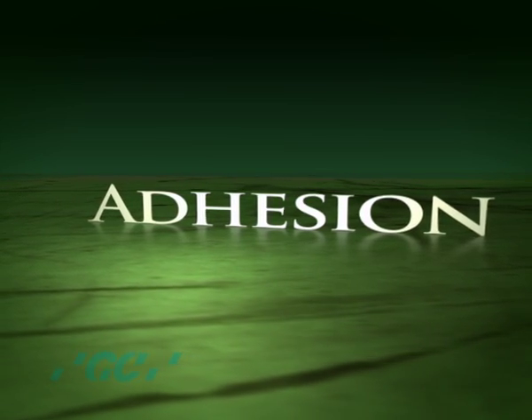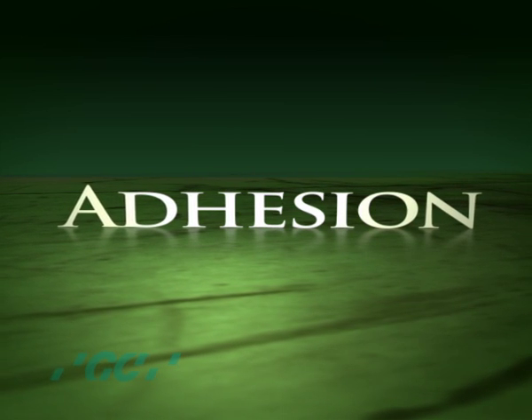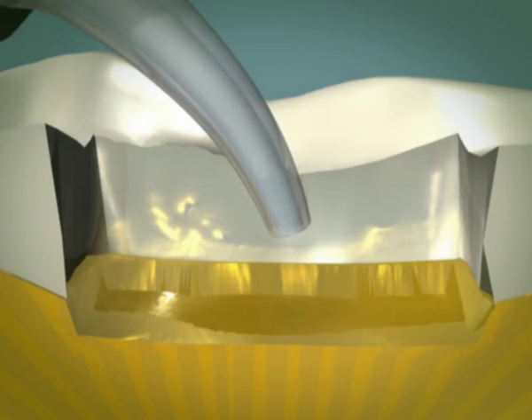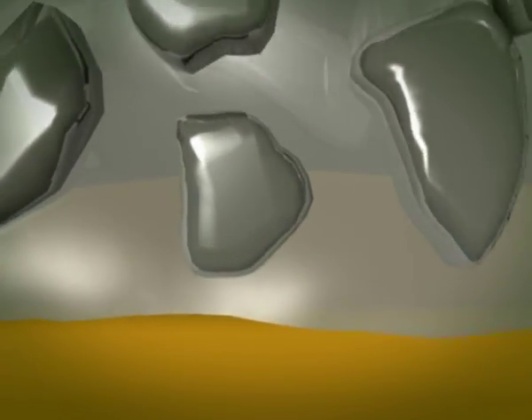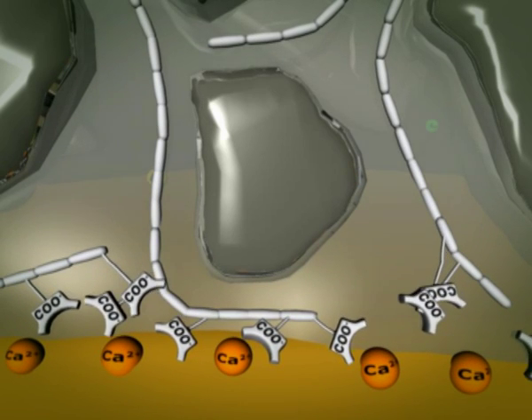Immediately after mixing, it is essential that Equia Fill is placed while it has a glossy surface. The gloss is free polyacid, which is able to penetrate the cavity surfaces to form a strong, hydrolytically stable chemical bond to calcium ions within the dentin and enamel.